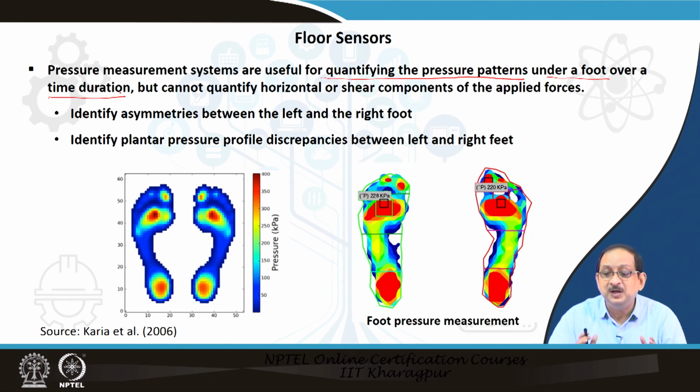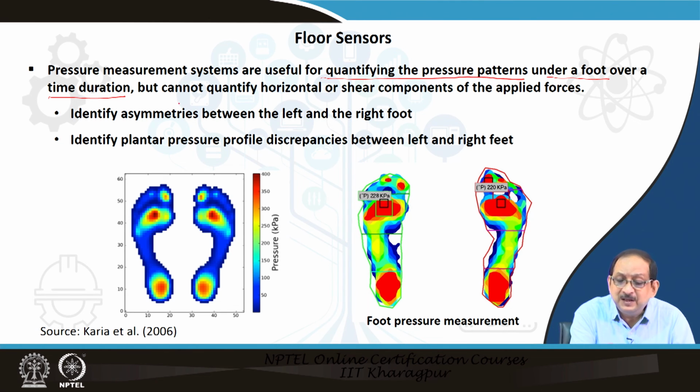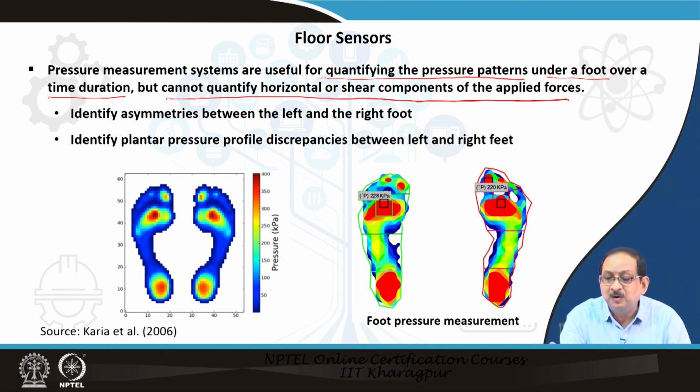It can measure pressure distribution during a time interval, but cannot quantify the horizontal or shear components of the applied forces. So it is basically a pressure measuring system, and doesn't give me any information on the forces.